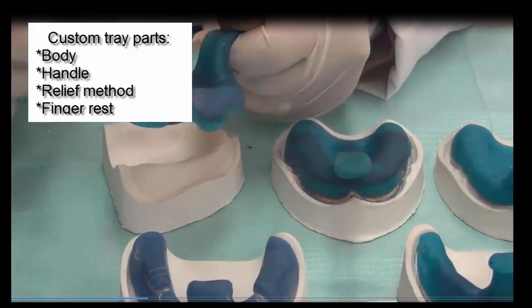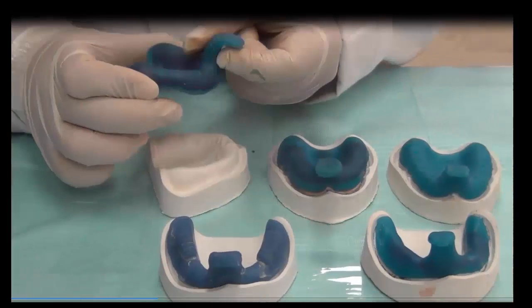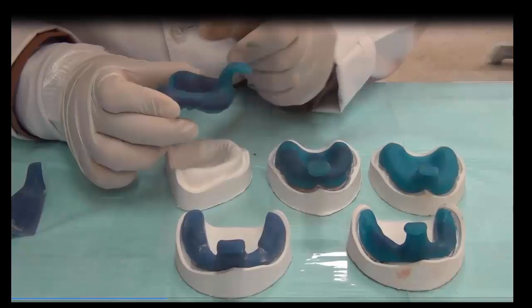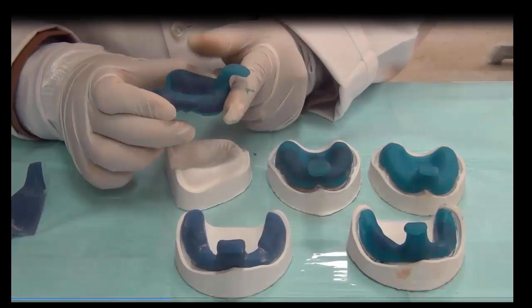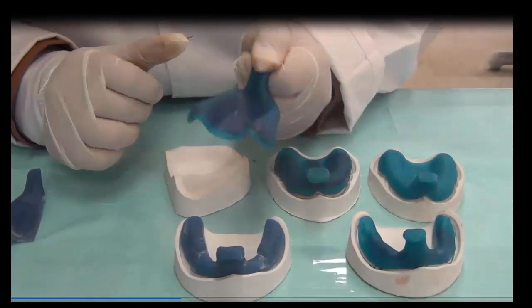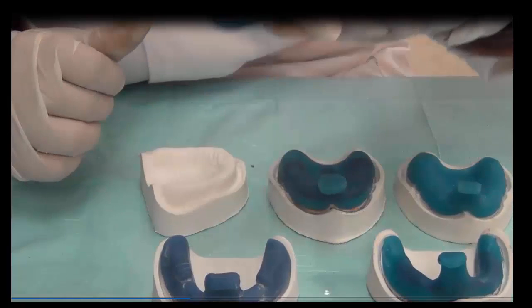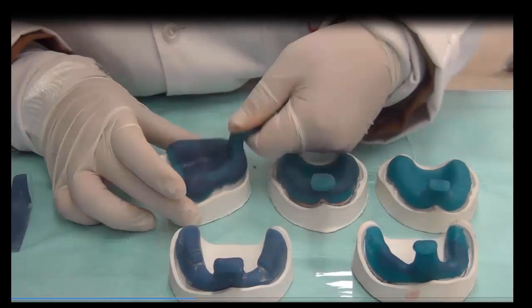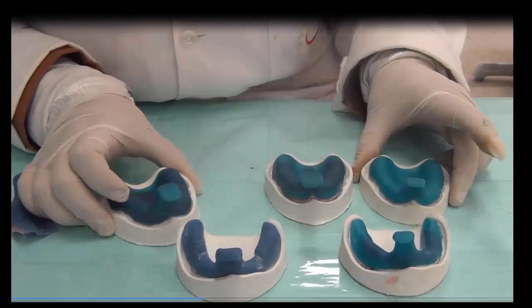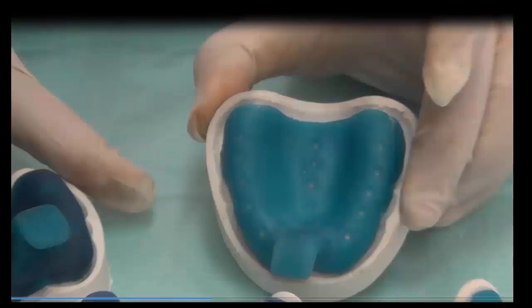So this is the handle, and it has the body where it's fused with the body of the tray, and then it has an arm that should be clear from the lip and the tongue. It should be slightly angulated, but not interfering with the lip and the tongue. And then it has a handle that the doctor could firmly hold it like this while taking the impression inside the patient's mouth. So from the outside, body and handle. Some bodies, we will have them perforated. We will talk about the perforations later on.